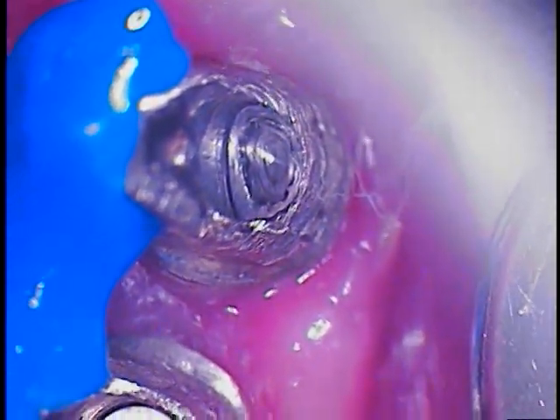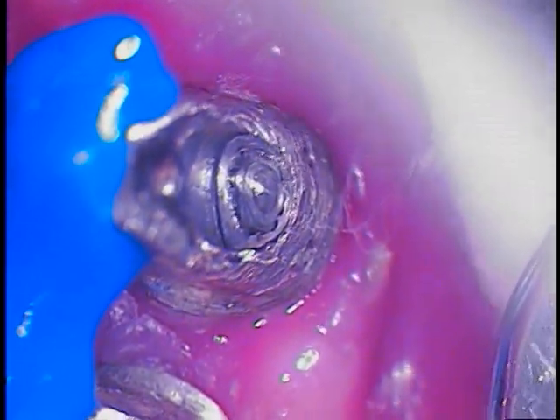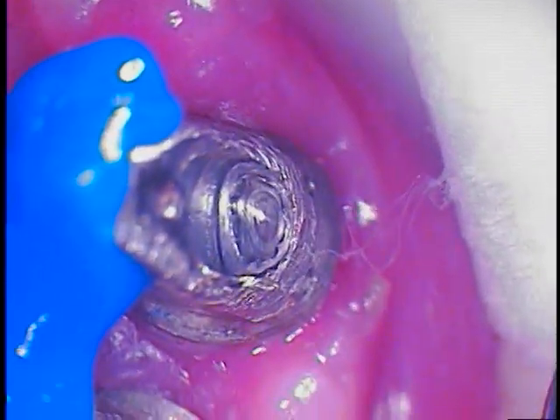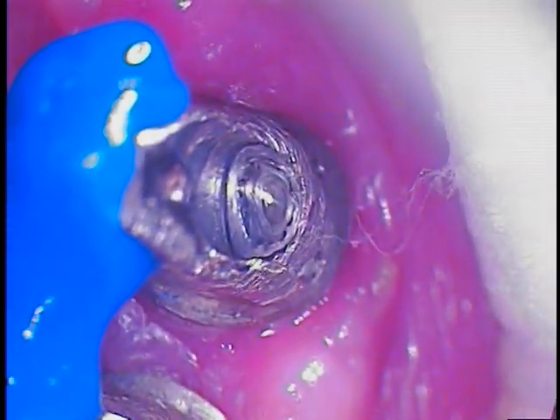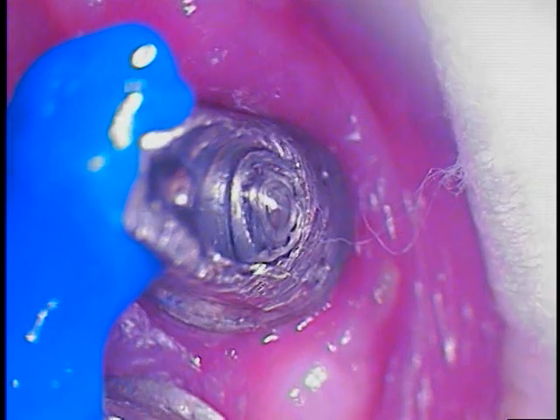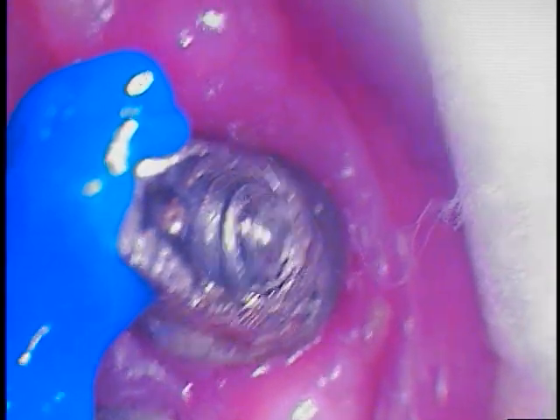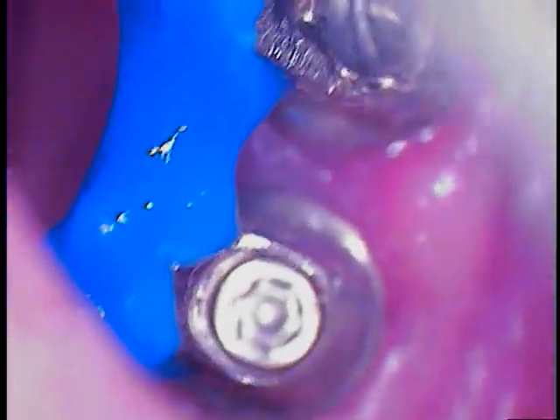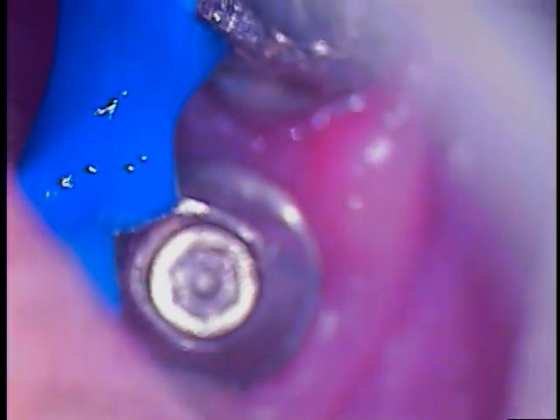I like retrievable cases because you can use other parts over and again. Even if a screw head strips, you can still get the screw out. Some companies make their screw heads welded all in one piece, and of course that doesn't make it very easy — but they also have the benefit of not having to torque them in as much. Different designs, different strokes for different folks. So let's come back on the next clip and we'll walk you through that next.